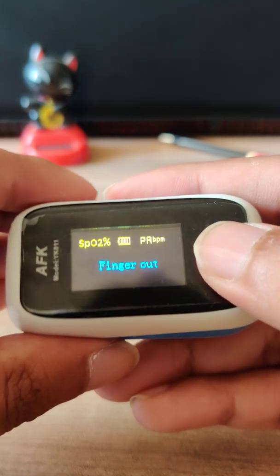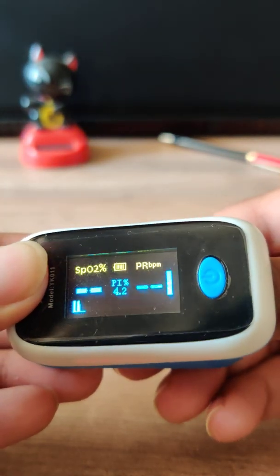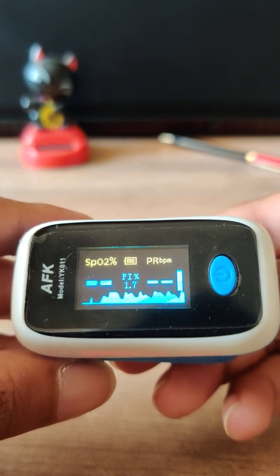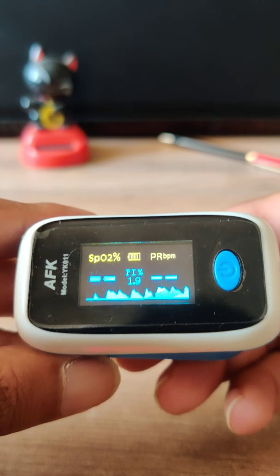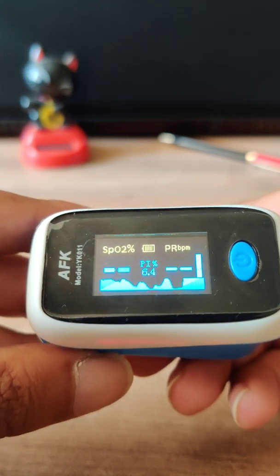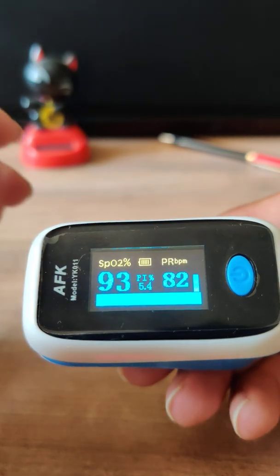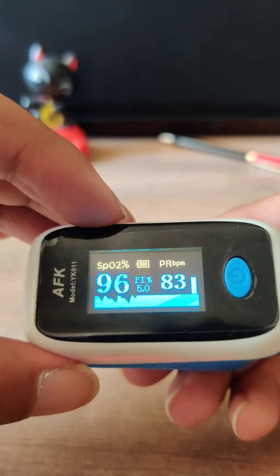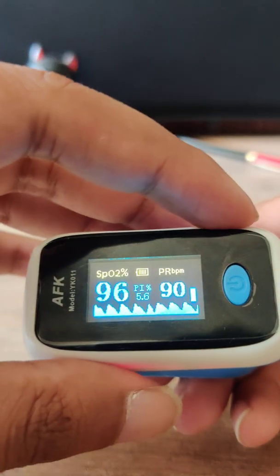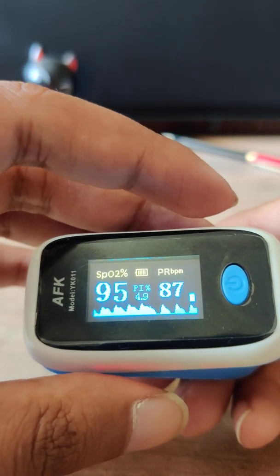To use the device, open it like this, put your finger in, and keep waiting for the device to take a reading. It takes on average a minute or two to register — make sure your finger is closely placed inside. The device is split into two parts: the first is the SpO2, which is your oxygen level, and the second is the pulse rate or beats per minute, which is around 88 to 90 in my case right now.